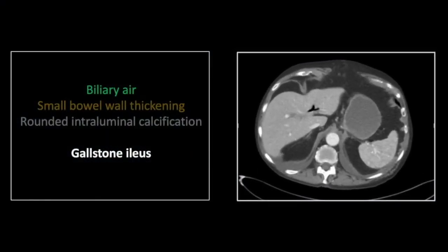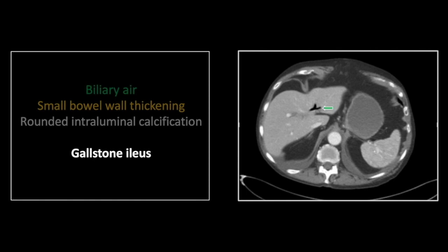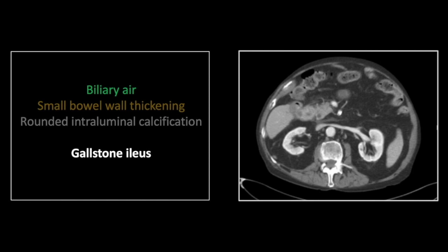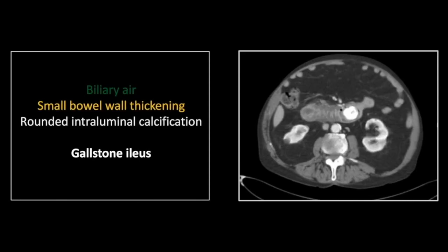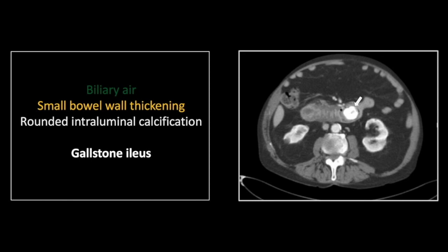Our next case is a gallstone ileus. This of course manifests as biliary air. Note the central arborizing gas here in the periportal region. Lower down you can see a thick-walled gallbladder fundus with a little bit of contrast or calcification within it and a small focus of gas. There is actually a communication between that gallbladder fundus and the adjacent duodenum. Lastly, you can see a thick-walled dilated duodenum and a large faceted gallstone in the second most common region for a gallstone ileus to cause obstruction — that being at the ligament of Treitz. The first most common region of course being the ileocecal region.